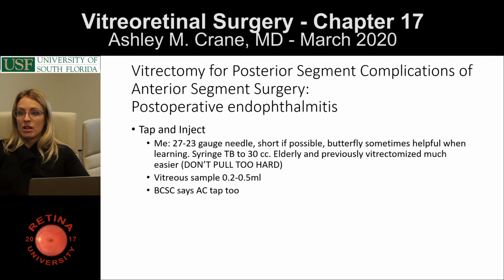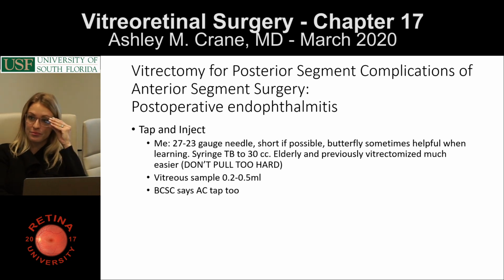Yeah. I've moved to doing it with the patient sitting up, because when you look at ultrasounds, the vitreous kind of falls, and then I aim a little high, and I use a 26 gauge, and I leave a little tiny bit of air in the syringe, and I'll try to pull, and if I can't get it, then I push the little air to clear the syringe, move a little, and try to pull, and then if I can't get it, then I do an AC tap.